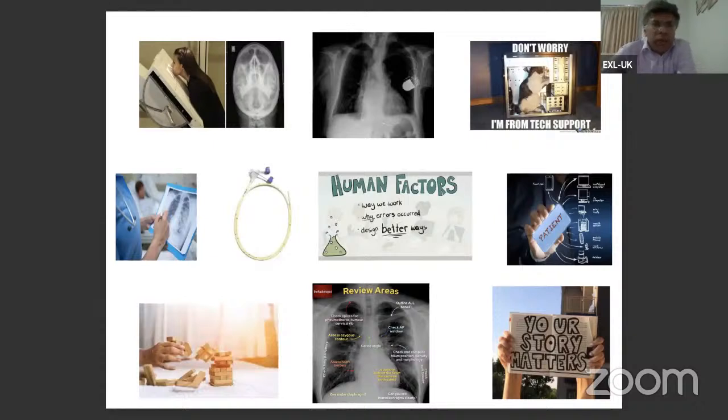And going back to when we talk about chest X-rays and the various things about chest X-rays, what is the specific reference to chest X-rays? There could be errors related to the actual process, to the exposure. Yes, it could be the positioning of the patient, the exposure of the patient, and also related to IT problems. Now, demographics, your patient data, patient information, that can always be wrong.